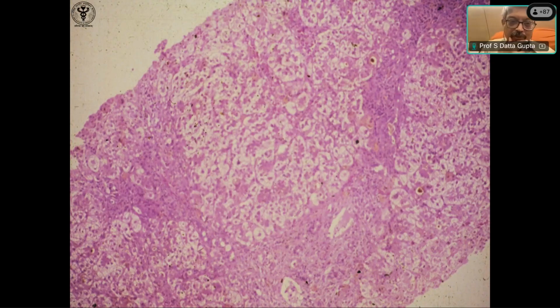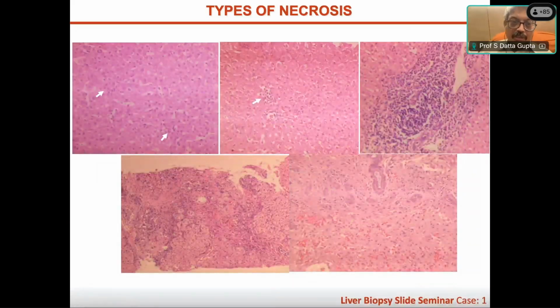In general pathology, you must have learned the sodium potassium pump. So that is what ballooning is. In liver cells, they become enlarged at least 1.5 times, right? And there is cholestasis, and there is necrosis from one vascular area to another vascular area. So that is bridging. It looks almost like cirrhosis. So that brings us to the question of what are the types of necrosis. If one or two cells are necrosed, it's called spotty necrosis.